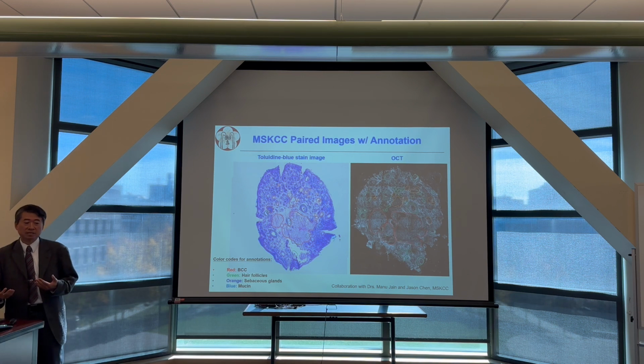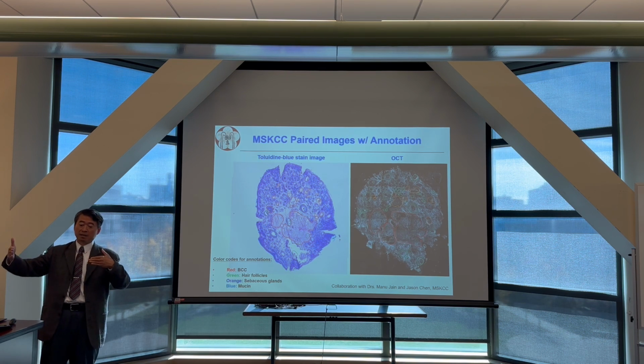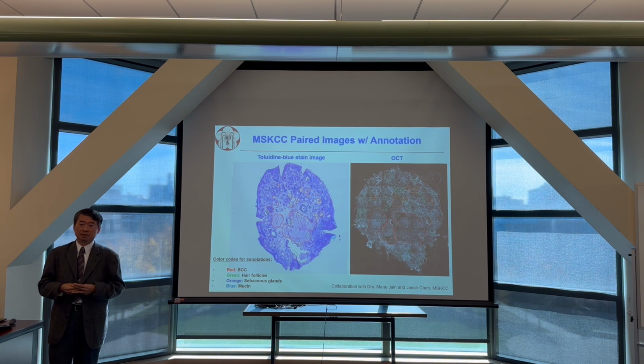Oh, because in OCT, we call this optical sectioning. For the microscope in the front, if you use a laser, you always have an interference pattern. But for OCT, because it's a broadband light source, only when the back reflection from a certain depth matches the length of your reference arm do you have a signal. So we have a kind of depth sectioning capability. Yeah. And then at that point that spectrum is what you capture. Yeah. Yes.